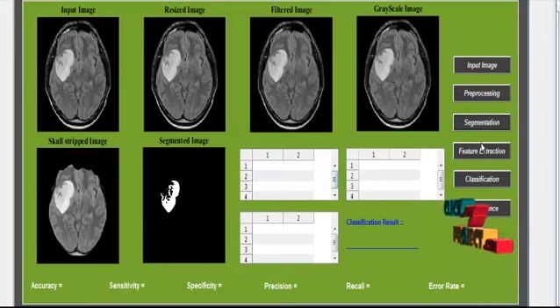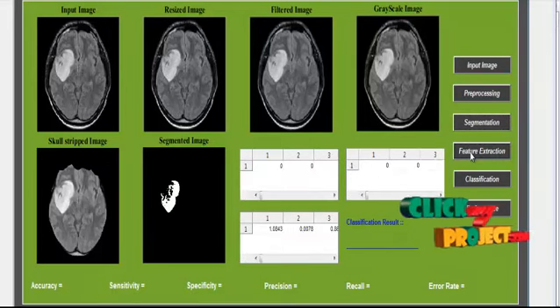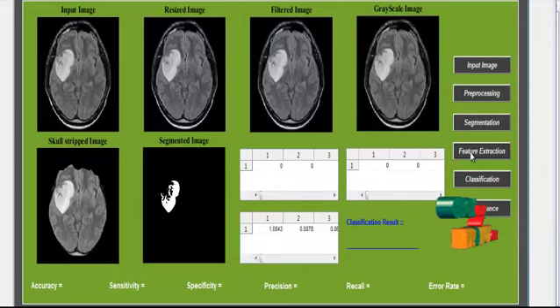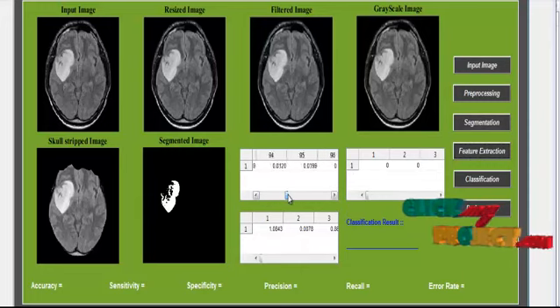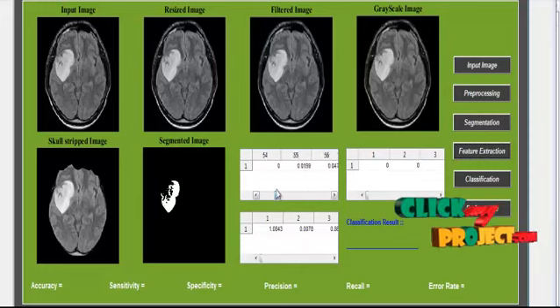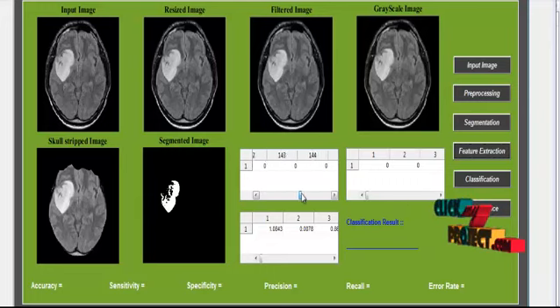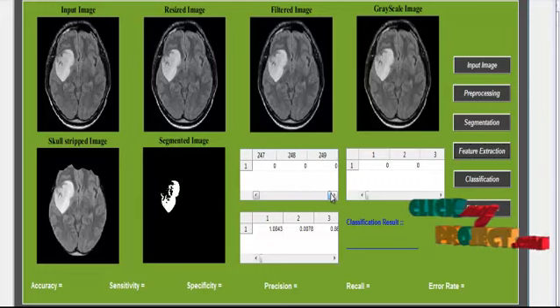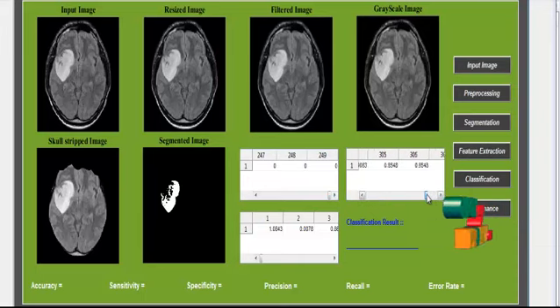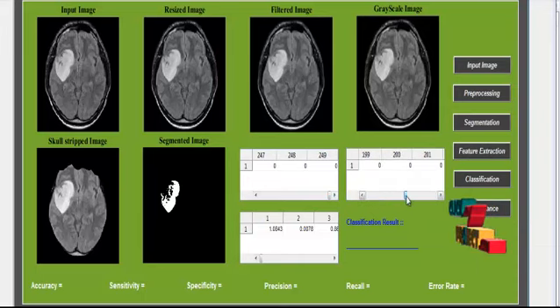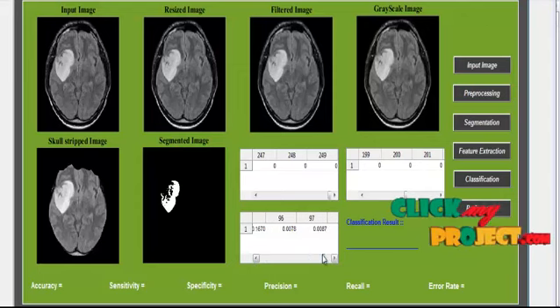After that, we move to feature extraction. In feature extraction, we extract features from the image by means of patterns and edges. These features are shown in tables: table 1 represents the edge features, table 2 represents the pattern features, and finally the combined test feature is generated.